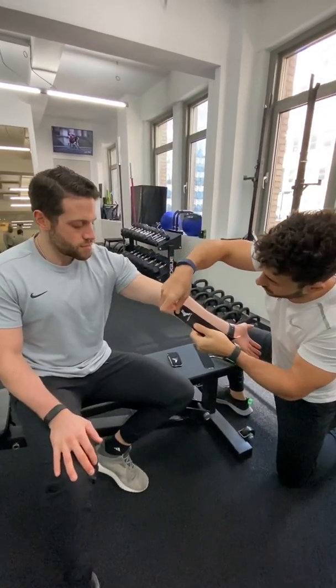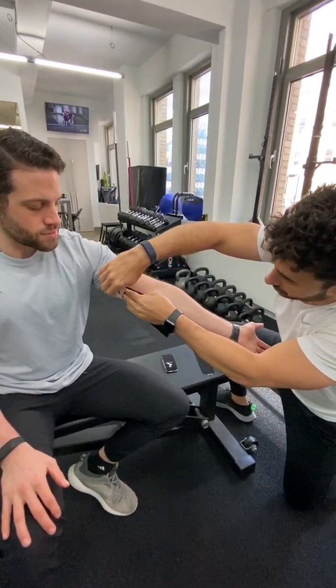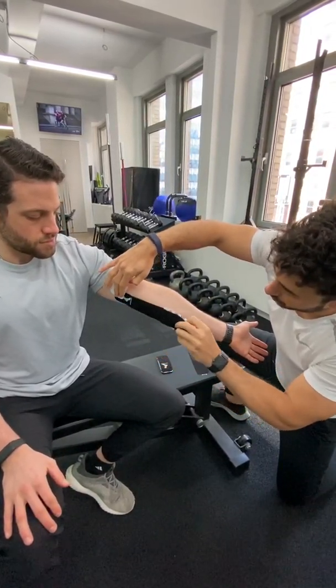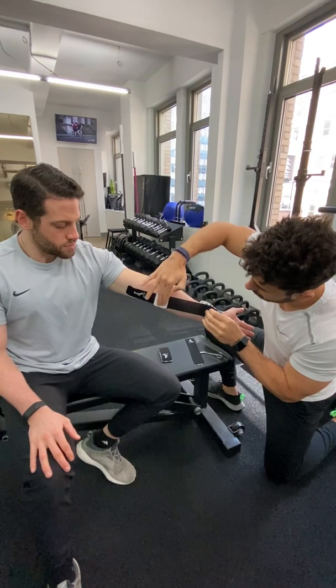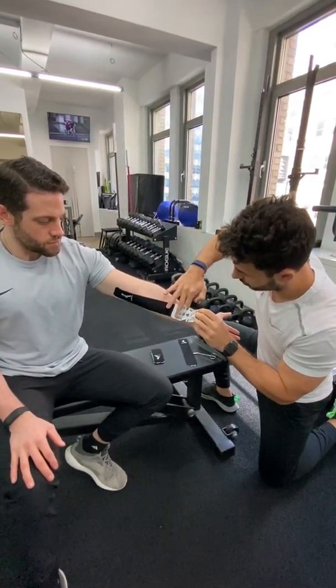We're going to go above the joint — he's having pain right in this area here. So we're going to go right above the joint, anchor it down, lay it flat, give a little heat to the area to get the glue to stick, and then we're going to pull it at a 50 to 75% stretch, just cross the area, lay it down, and then go back to a 0% stretch to anchor it all the way at the bottom.